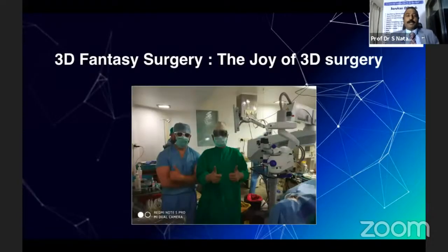So coming back, thanks to Zeiss for what I call 3D fantasy surgery, and the joy of doing 3D surgery is really great, and I'm enjoying it because I actually designed a Maharaja chair. That means you can sit like this and operate. I never thought you would operate like that, because I always used to tell you to sit erect like that and operate. But here, Dr. Eckhart used to call it head-up surgery.